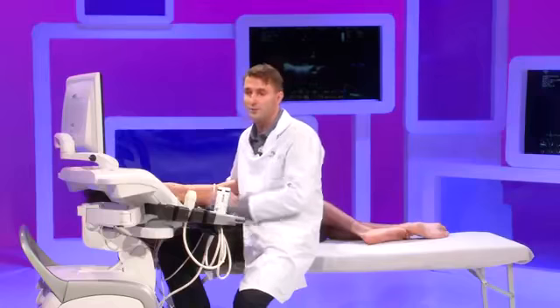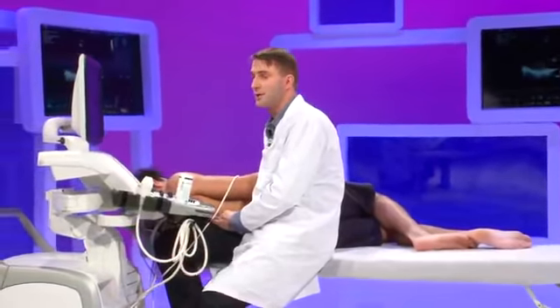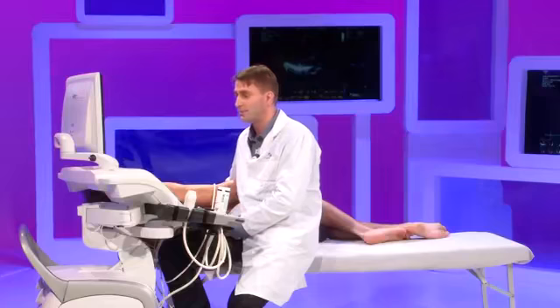Also very important before every echo examination is that the room is darkened to have optimal image contrast, and that the room is silent, because you have to use the audio to optimize your Doppler signals. As well, every echo examination has to have a good ECG, because the ECG is used for timing, and you cannot do analysis of diastolic function or any other timing of asynchrony without a very good ECG. So this is before starting the examination.